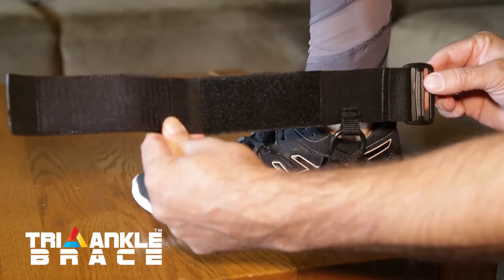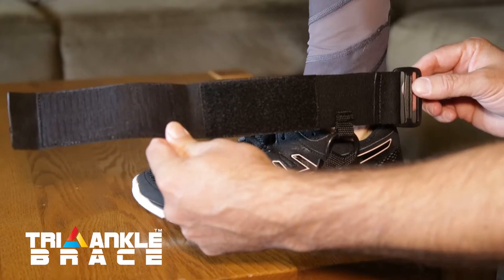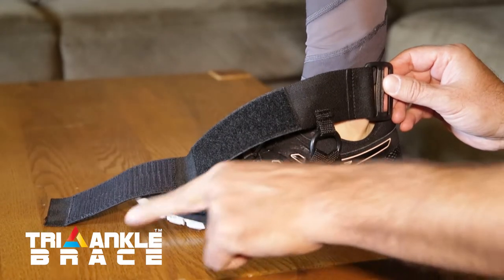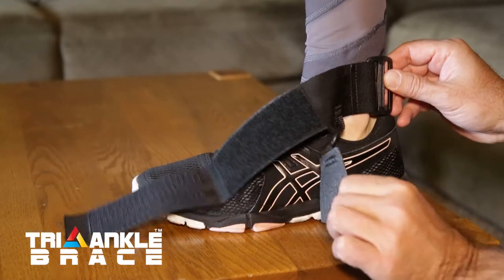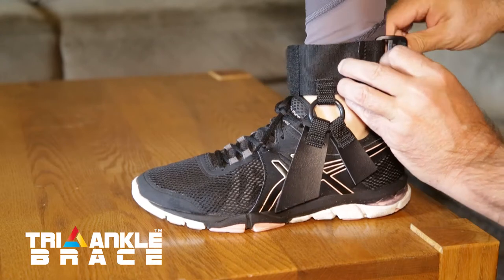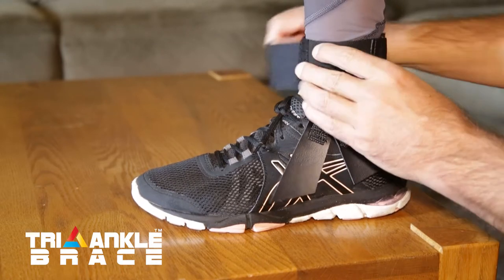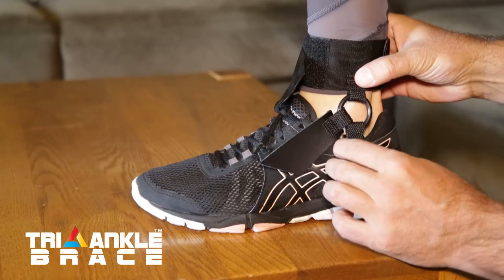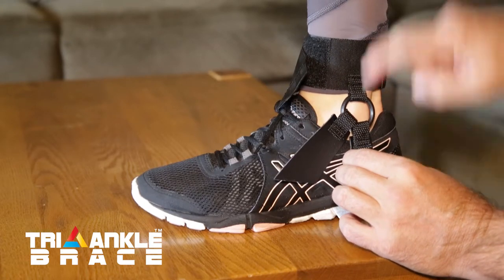Step one: make sure you have the right side. This is a left, so with the buckle at the back of the foot, this arrow points forward and the unfinished side of the leather is towards the shoe. Velcro it on the thinnest part of the ankle, snug. Now you want this piece, this little short piece, to be perpendicular to the ground.